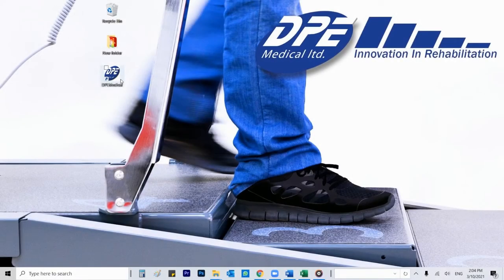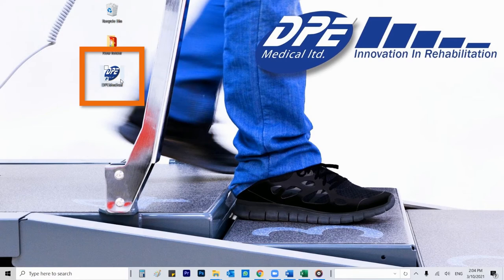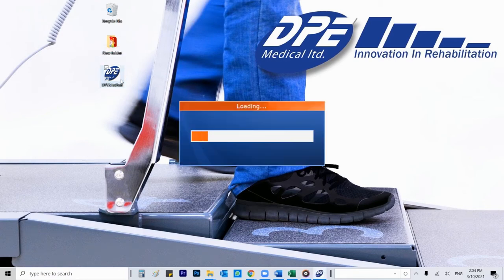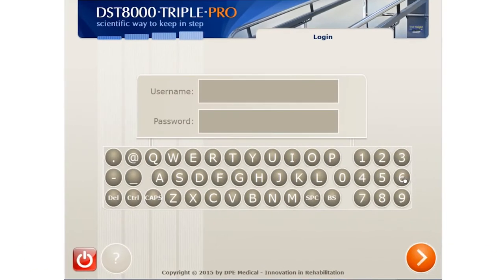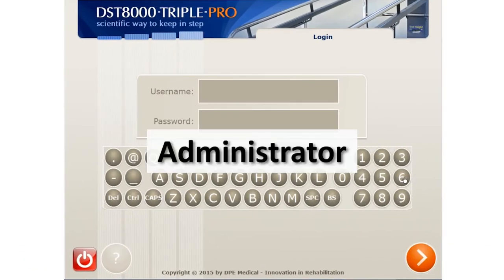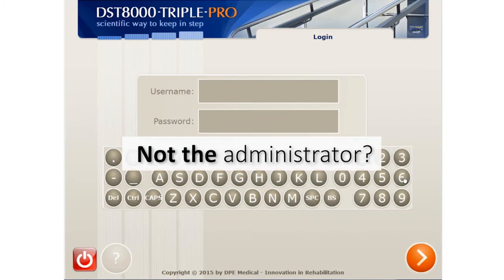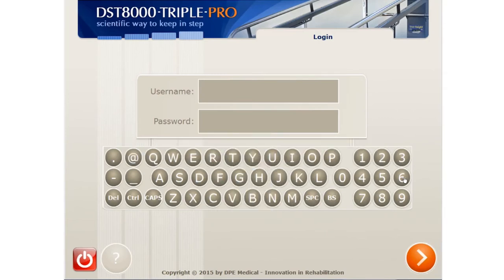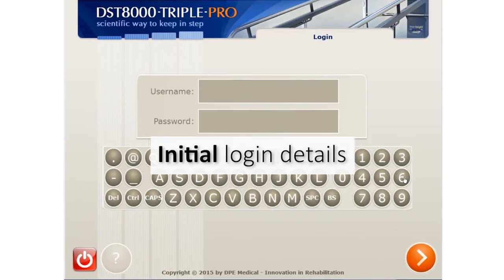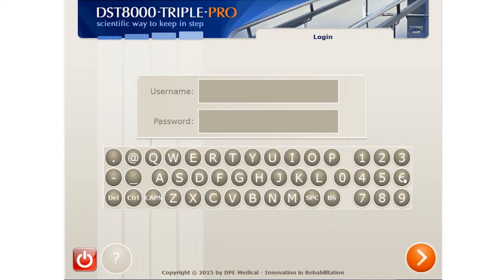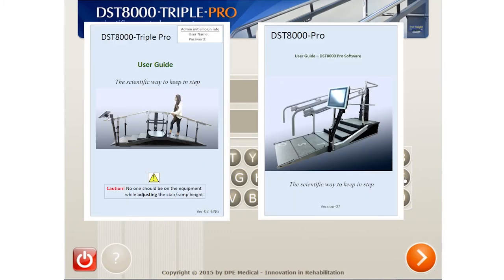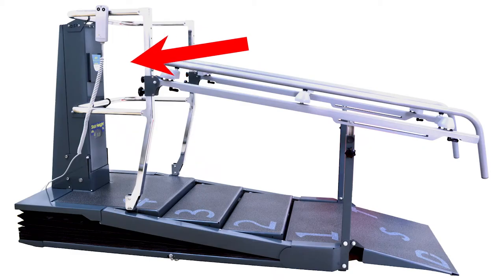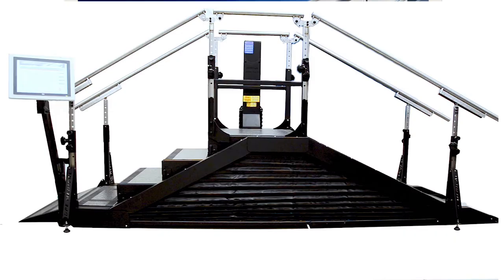On the desktop, you will find a shortcut to the software. The first login should be done by the administrator, who has wider permissions than other users. If you are not the administrator, you can jump forward to this timecode. We provided you with initial login details — you can find them on the cover of your user guide, which is located on the main pillar of the device.